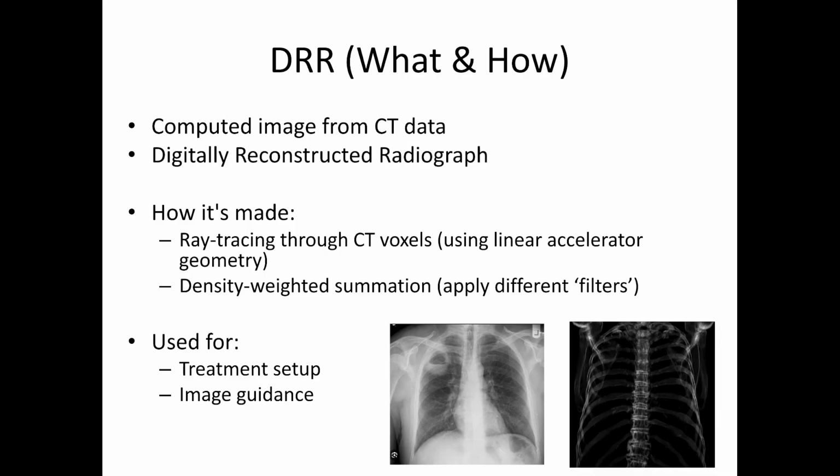Different rendering filters can be applied to emphasize specific features, allowing the DRR to resemble either a kilovoltage or megavoltage image. DRRs are primarily used for treatment setup and image guidance, serving as reference images for comparison with portal images or KV imaging during patient positioning.